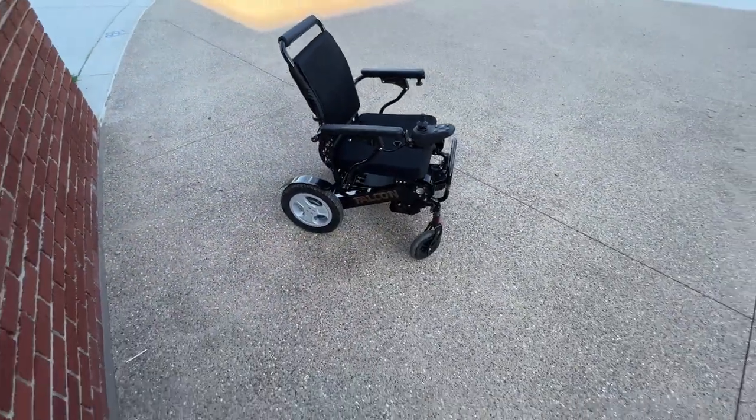I want you to understand that I'm applying constant pressure to the joystick in order for the chair to move. If I'm very floppy with the joystick, I'm giving it too many commands in a short period of time for it to understand where to go. I chose to do this video in a parking lot because we have handicap-accessible areas which make things pretty simple. You can see the chair has no problem going up and down these handicapped-accessible areas.